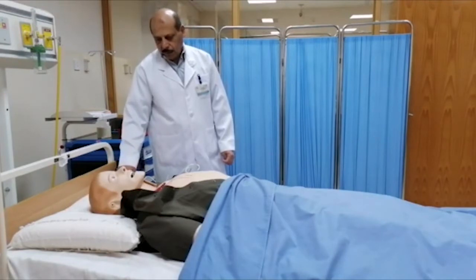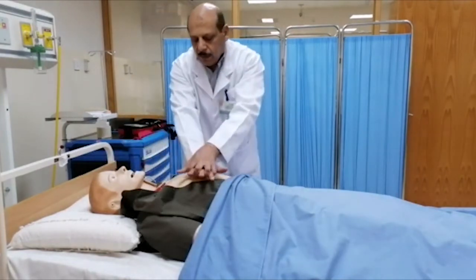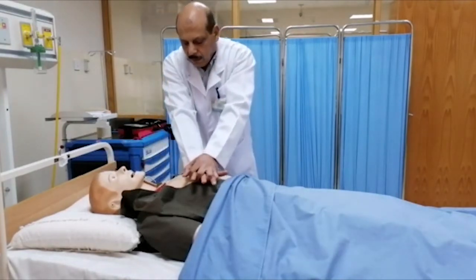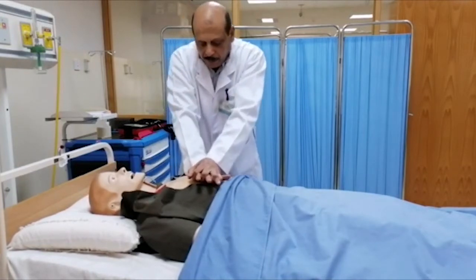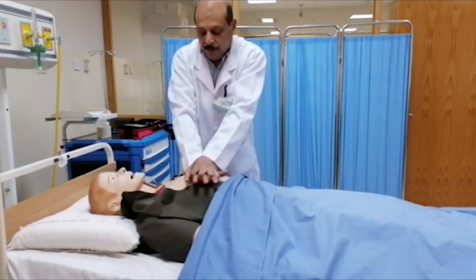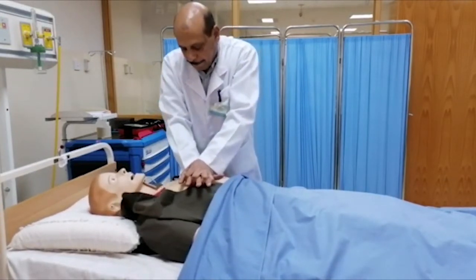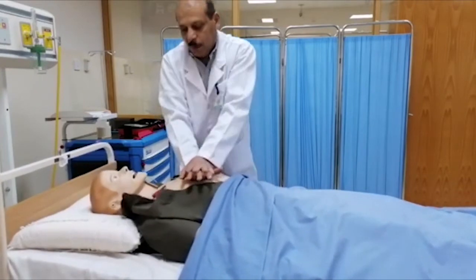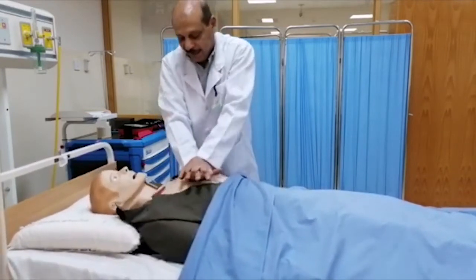Place the heel of one hand in the center of the chest between the nipples. Place your other hand on top first. Push the chest down firmly five centimeters. Keep time with the beat.